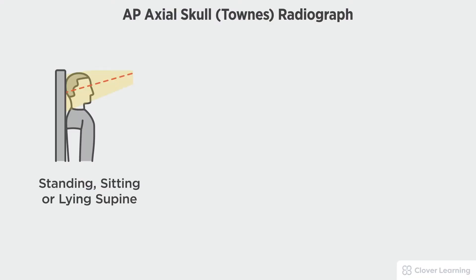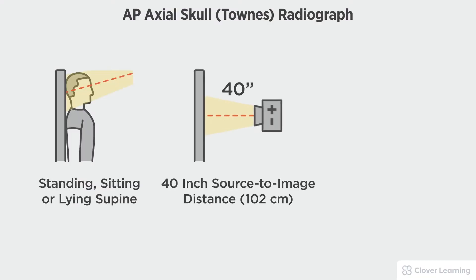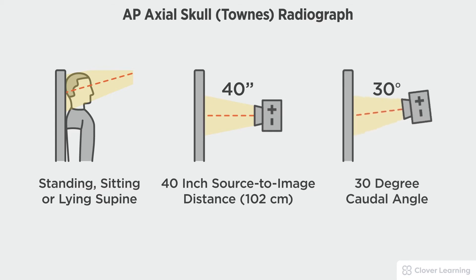In this view we will be demonstrating the AP Axial Skull Towne's view. The AP Axial Skull Towne's view should be performed with the patient standing or sitting at the upright bucky or lying supine on the table with a 40-inch source to image distance and a 30-degree caudal angulation.